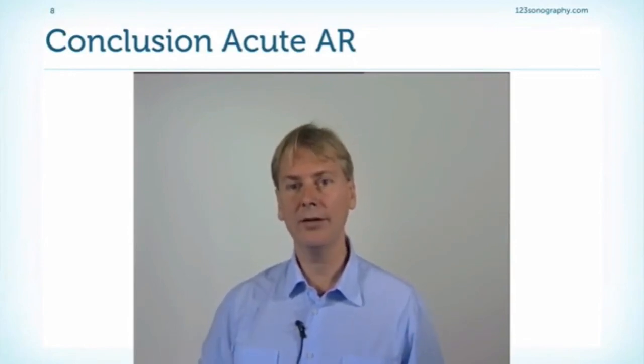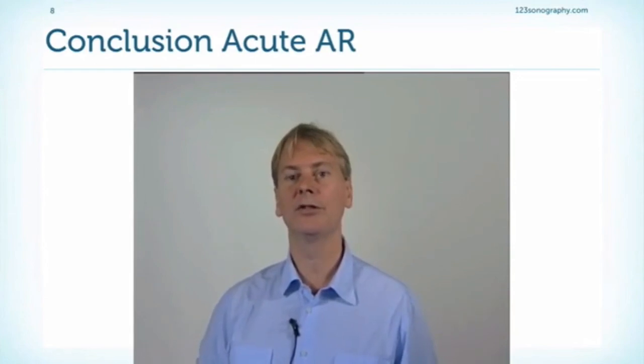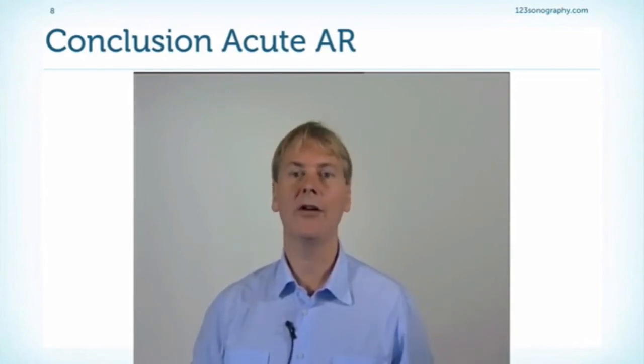Now that we've seen how to quantify and to assess aortic regurgitation, let's take a look now at how echocardiography can help us in the management of these patients.